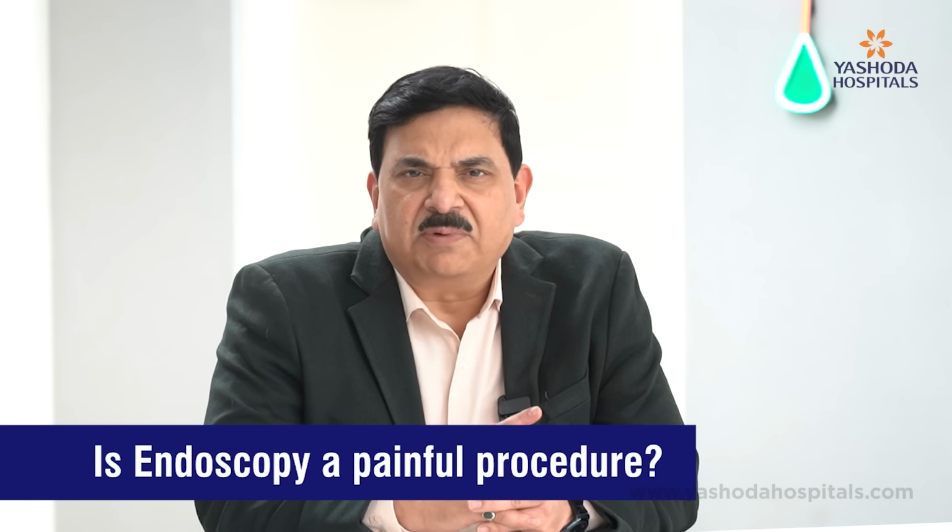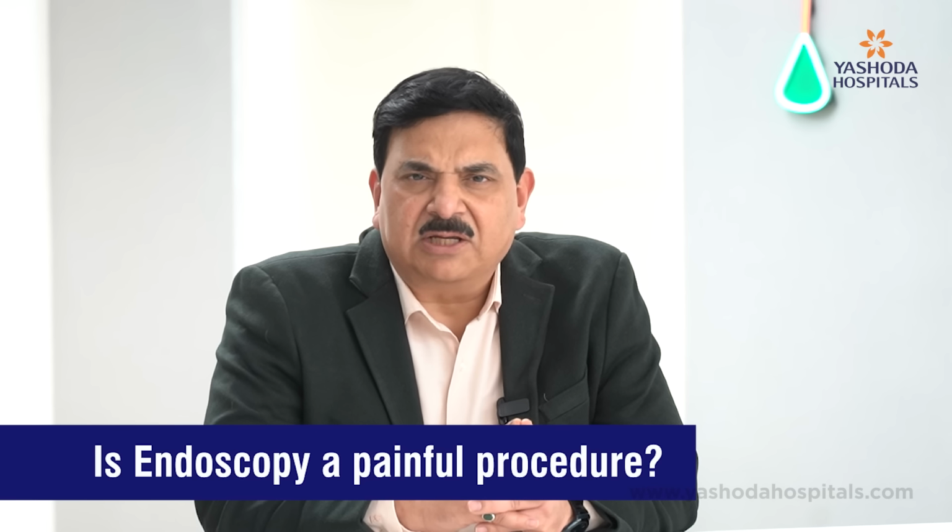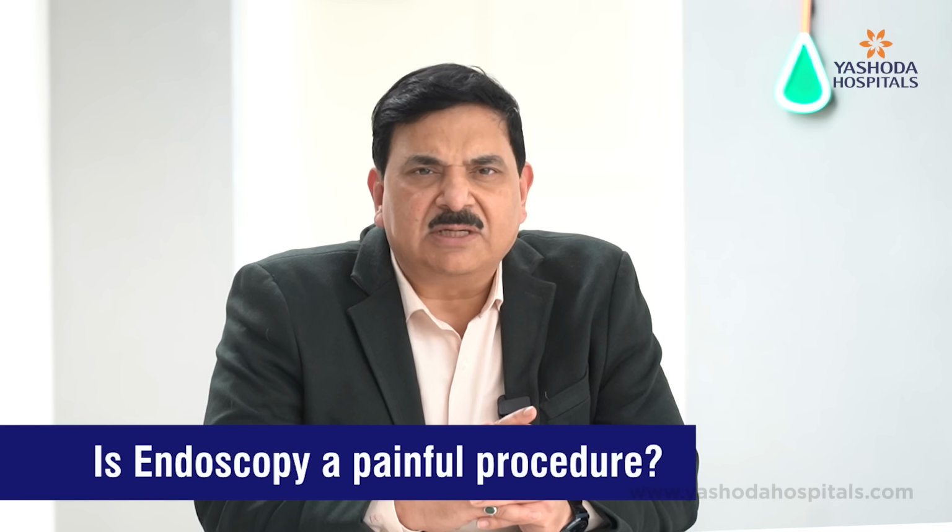So during endoscopy, the patients will not have any pain, especially if they are anesthetized. Sometimes if the patient prefers to have an unanesthetized endoscopy, they can have some discomfort, but it's not a very big discomfort. So we can say that endoscopy can be done with anesthesia, which may be preferable, especially for some patients. And sometimes if it is done without anesthesia, also it is okay.